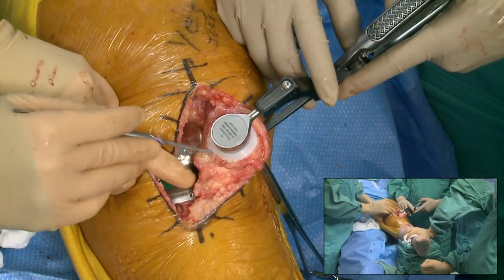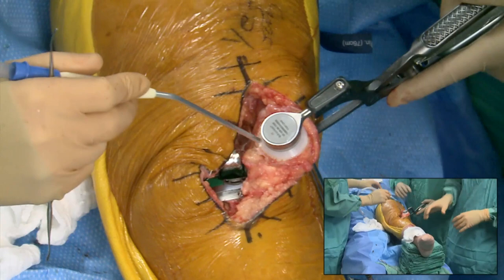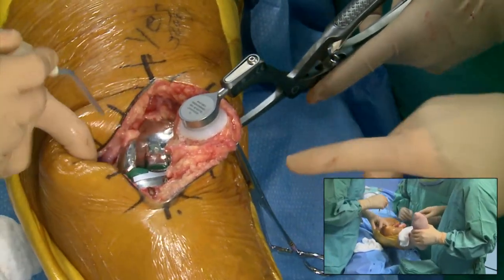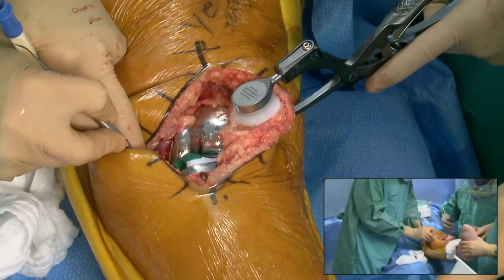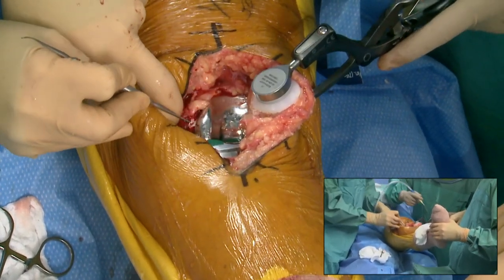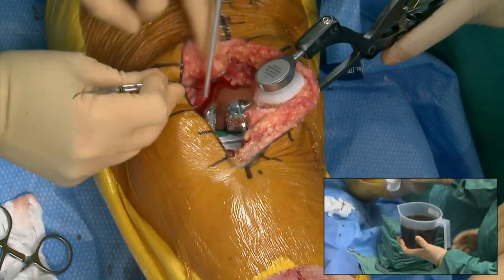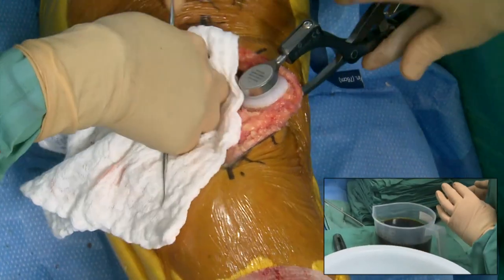At this point I let the tourniquet down. From here I leave it in extension, clean up any bleeding, and do a three-minute diluted betadine soak before irrigating and putting in the real polyethylene and closing.